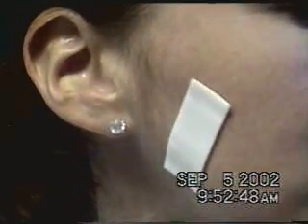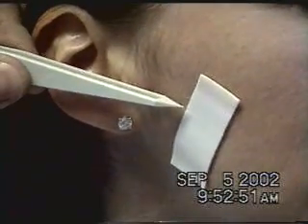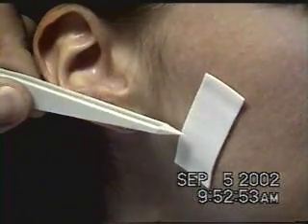One of the other things you'll see here is that the electrodes have little flaps on them — here's one and here's the other. These flaps are where we will attach the alligator clips from the EMG wires.